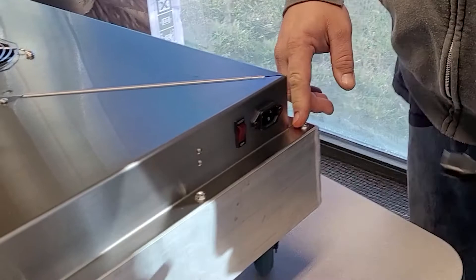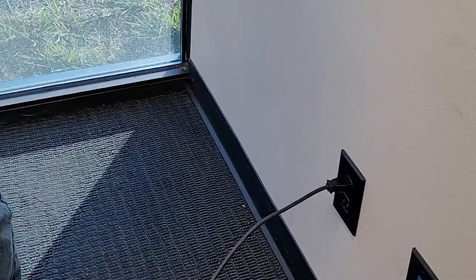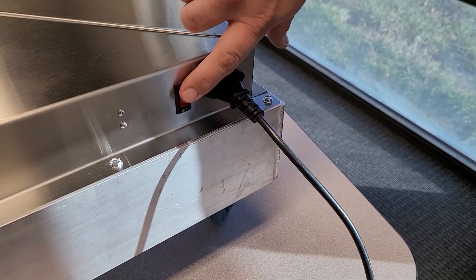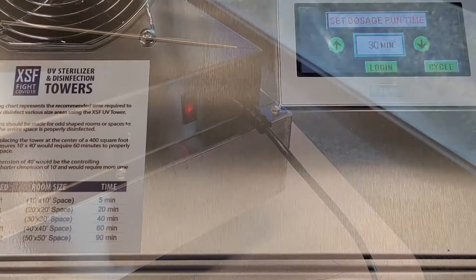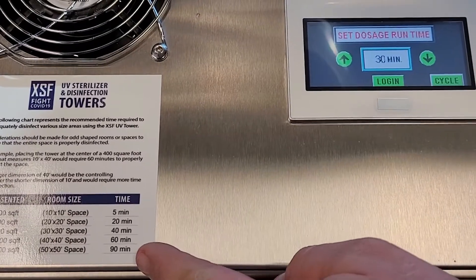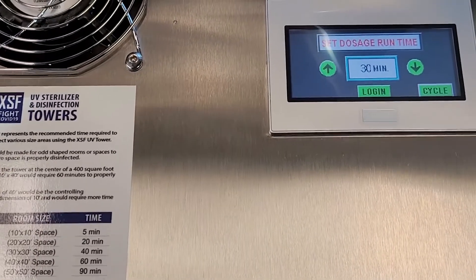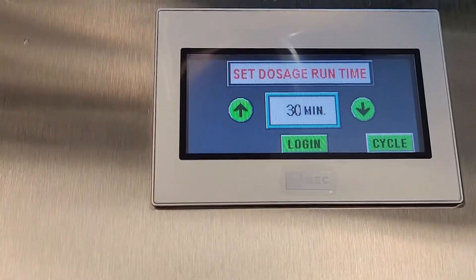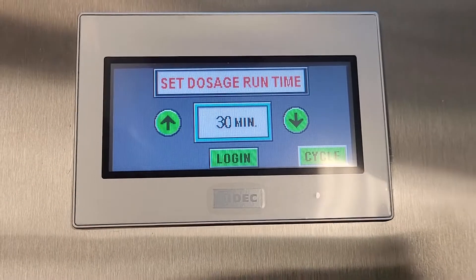Plug in the UV light tower into a power source. Flip the red switch to reset and ensure that the red light is on. Refer to the room size chart for the required run time. Set the desired cycle duration on the LCD touch screen display using the up and down arrows.